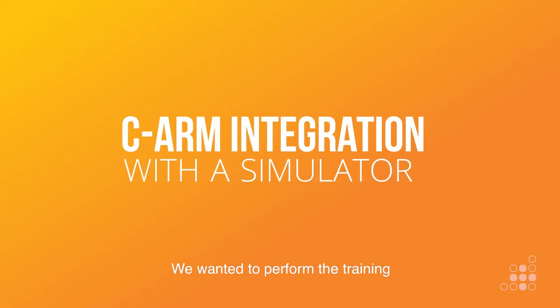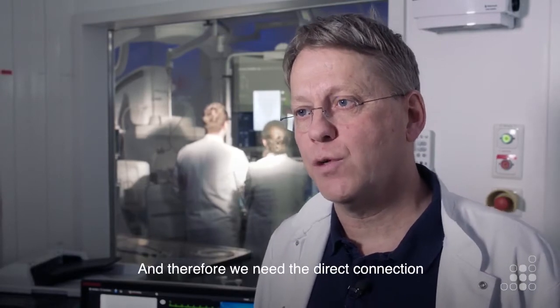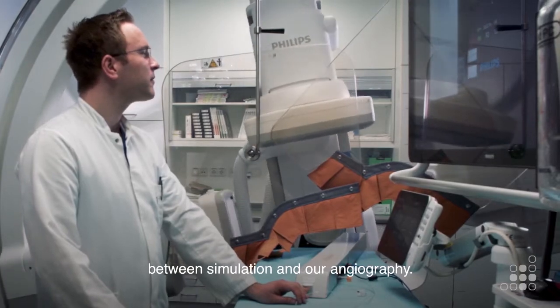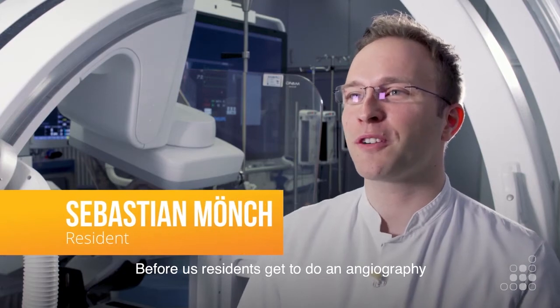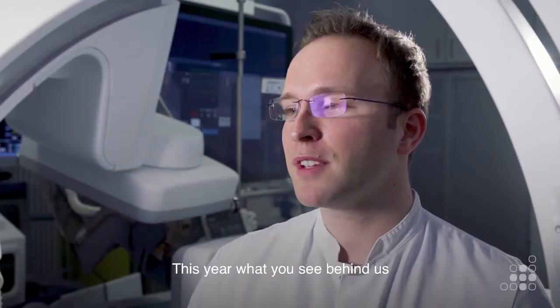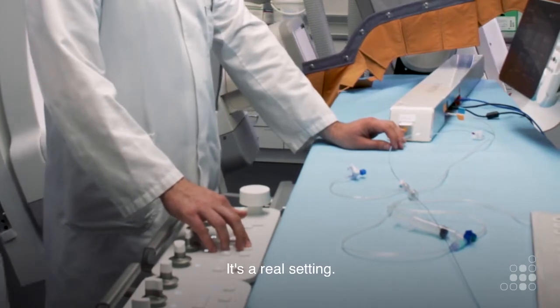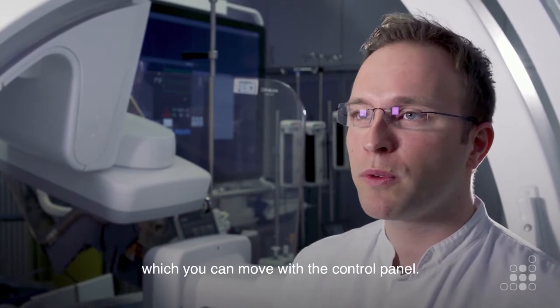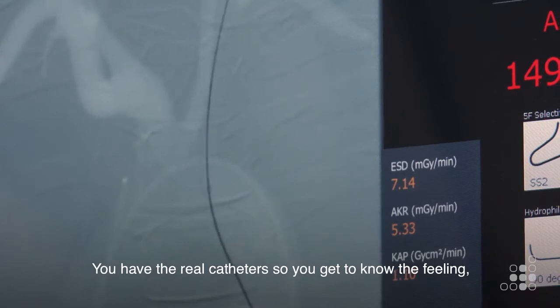We wanted to perform the training in a very realistic surrounding, and therefore we need the direct connection between simulation and our angiography. Before we residents get to do an angiography in a real patient, we have to practice with the simulator. What you see behind us is the real angiography suite. It's a real setting. You have the table, the control panel, and the C-arms, which you can move with the control panel. You have the real catheters, so you get to know the feeling of how it works.